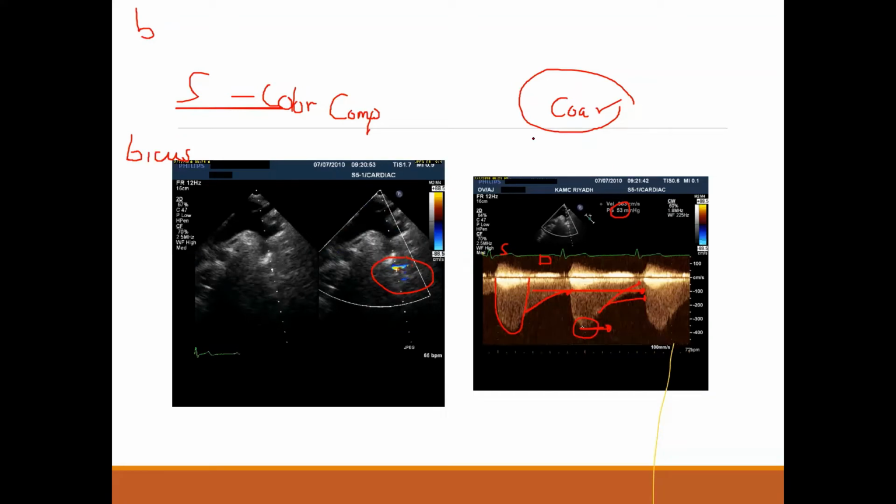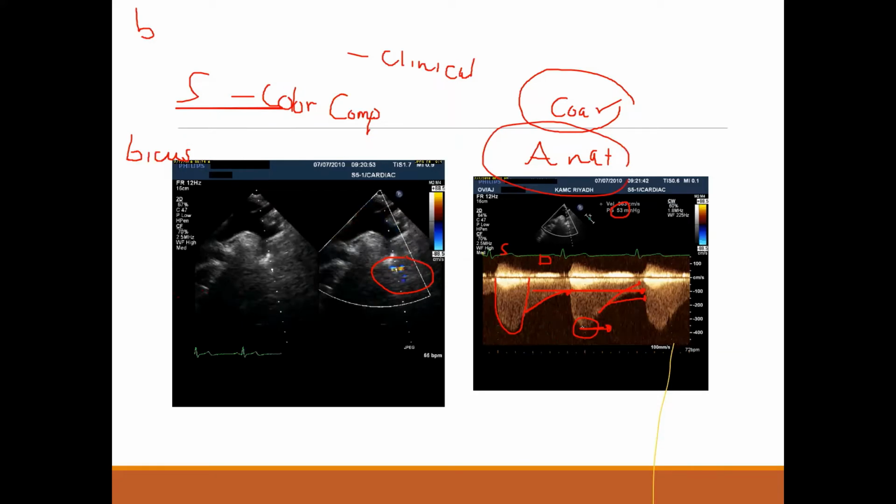Another important thing is anatomical data. We said clinical data, you were right, and full echo data, you are right. Somebody might ask, why anatomical data while we have echo which has shown us the anatomy? Echo is not good to show the anatomy here. It's always blind, we don't see beyond this spot, to assess the collaterals, their presence and degree. That's why we have to go for anatomical data by CT or MRI.